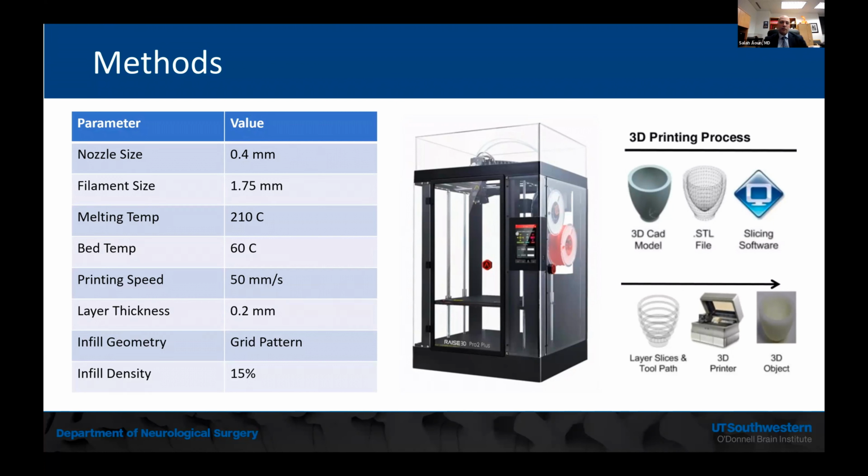The printing of a full spine, even with the best printers currently, can take up to 3 days and needs some degree of supervision. So this is not something you just leave at work and come back to the next day, unless you want to come back to a potential disaster or fire. We have these printers at home so that there's always someone that has eyes on them, and they have an integrated camera and a fire exhaust system as well in case something happens.